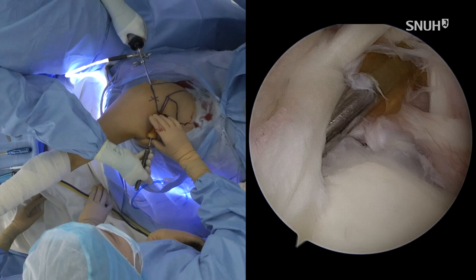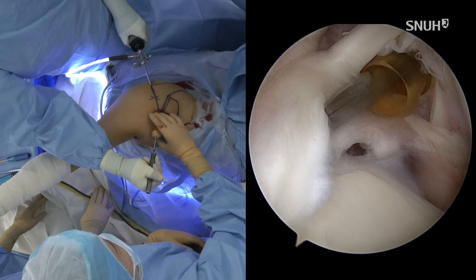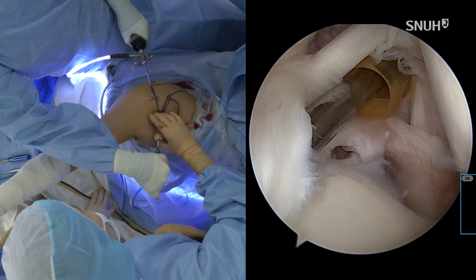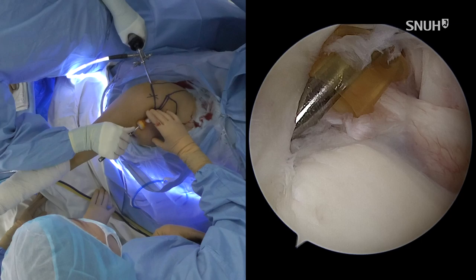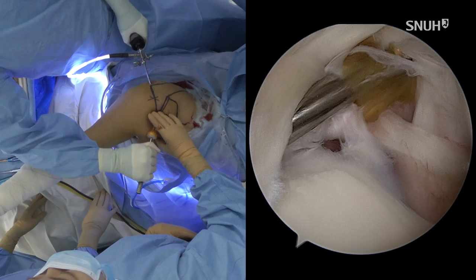After the sharp elevator, I like to use the blunt elevators to decompress the cyst. Here you can see the remaining cyst is coming out. On the CT scan, you can see the bony change around the cyst. So that means it's a really long-standing cyst that caused the remodeling of the glenoid, superior glenoid tubercle.